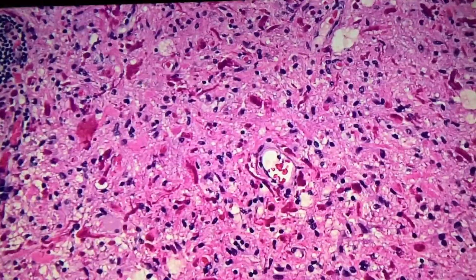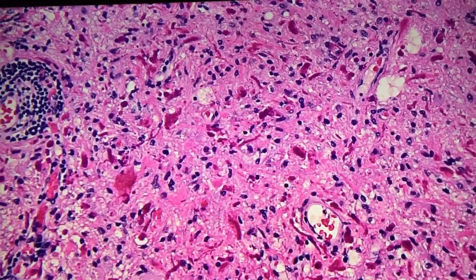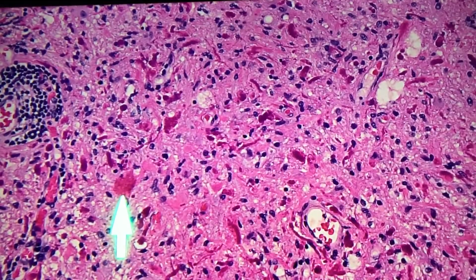Will you remember what a Rosenthal fiber looks like? Yes. Are they EGBs? Yeah, they're also eosinophilic granular bodies. Which ones? Can you point out one? Like the glob of eosinophilic granular body to the left? Yeah, like that. Eosinophilic granular body.